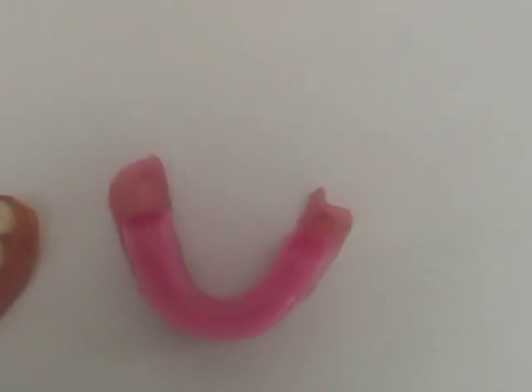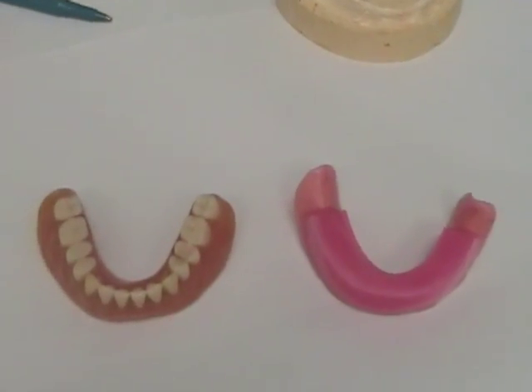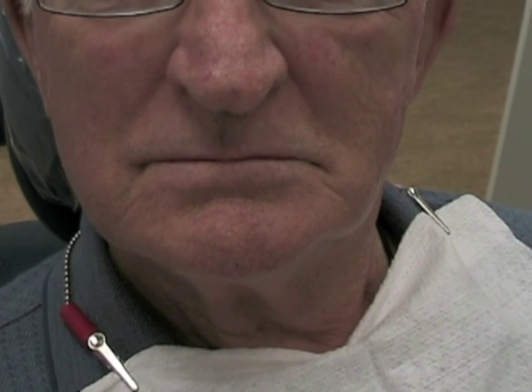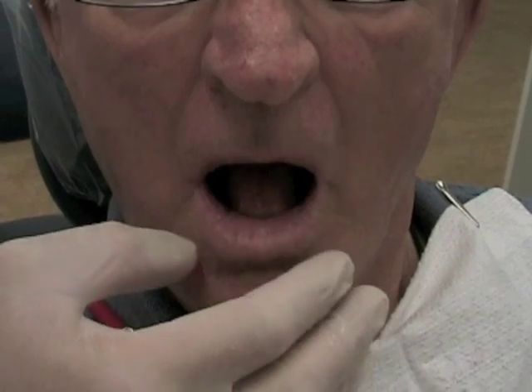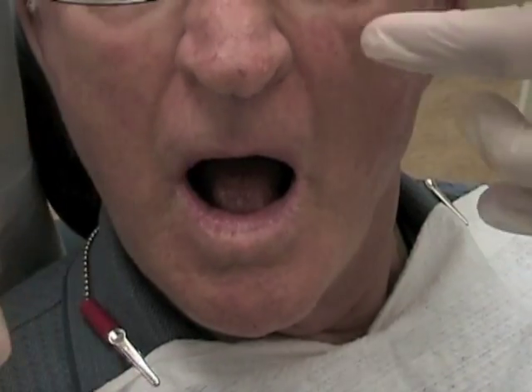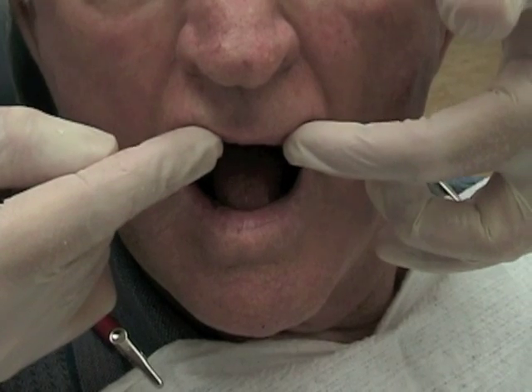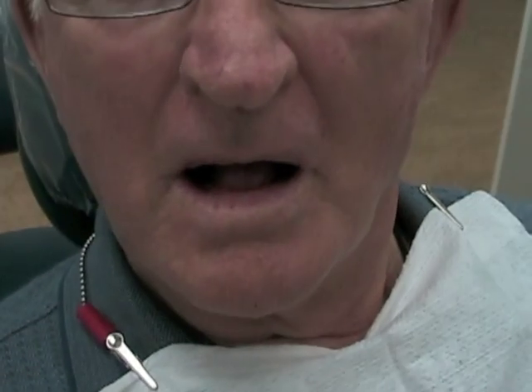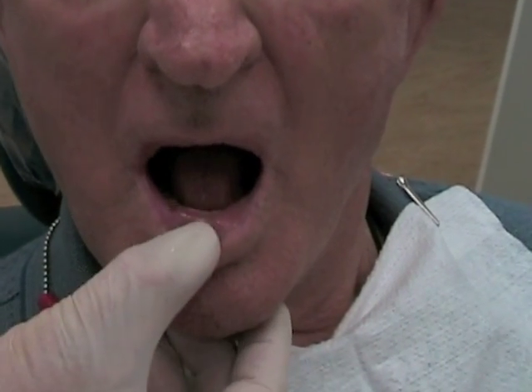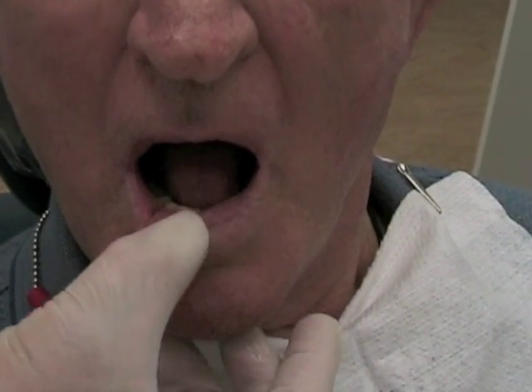Because the patient's denture won't fit on the master cast, we use a record base and wax rim to determine the occlusal vertical dimension. Before we begin to adjust the rims, we'll take the patient's existing dentures and look at what type of support and height the patient has with those dentures. You should be able to see the denture teeth just at the edge of the lip, so we'll make those determinations before using the wax rims.